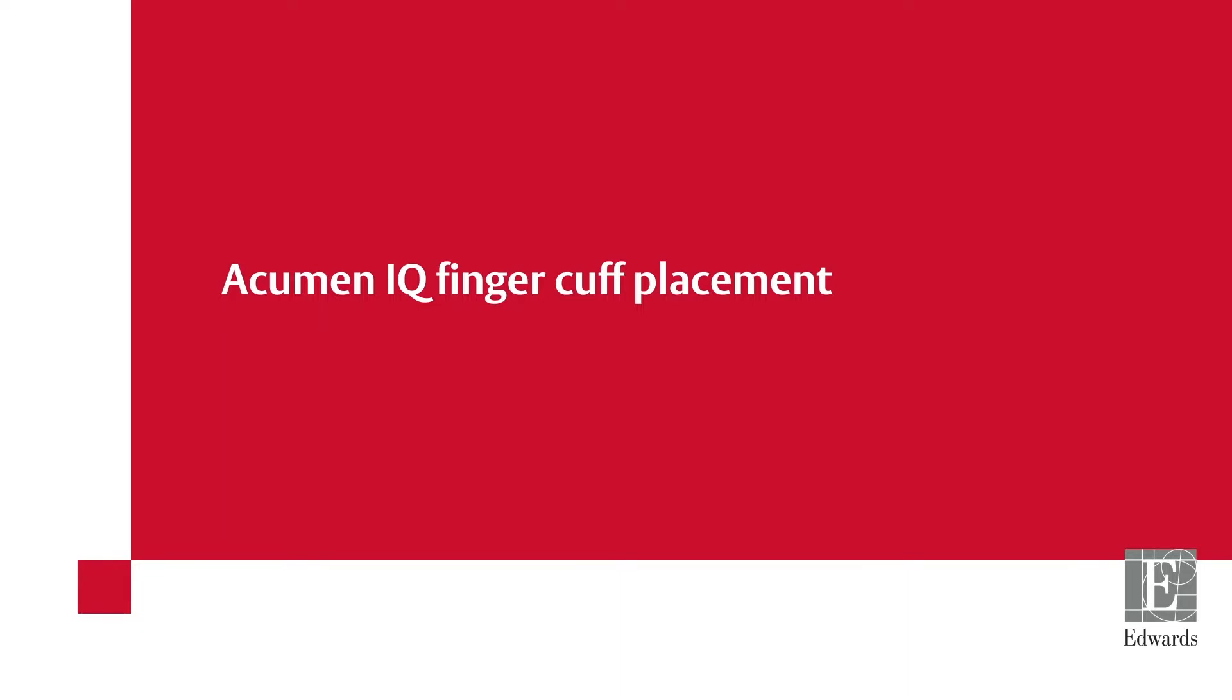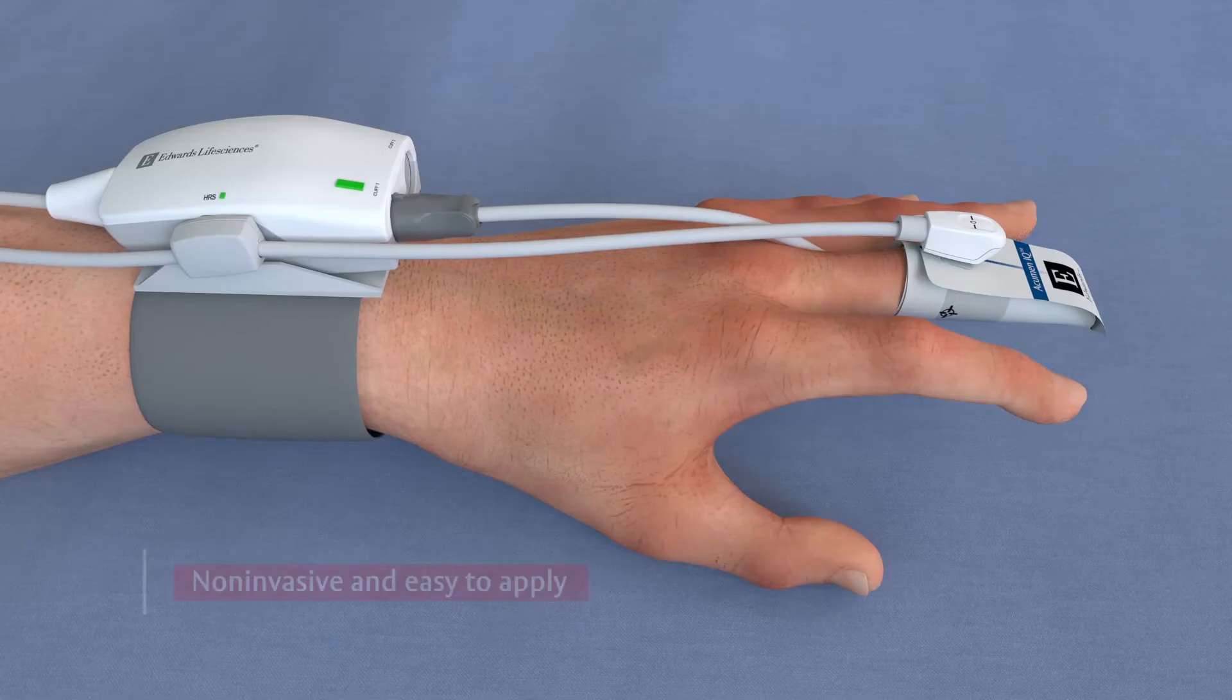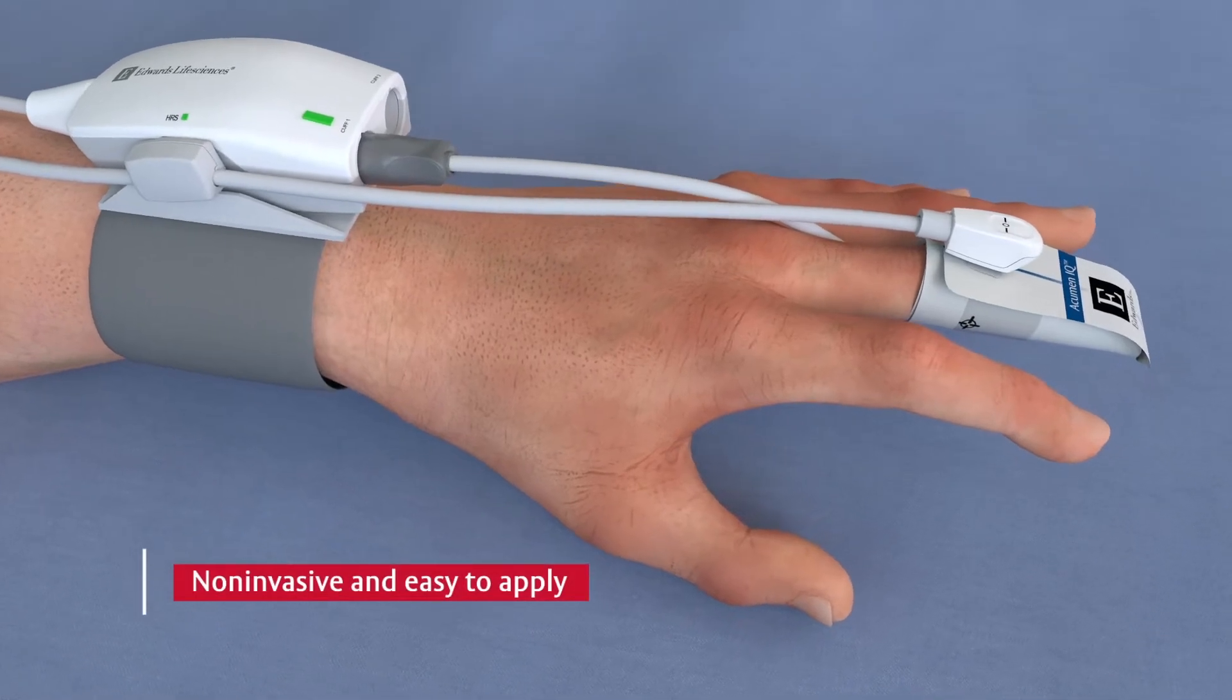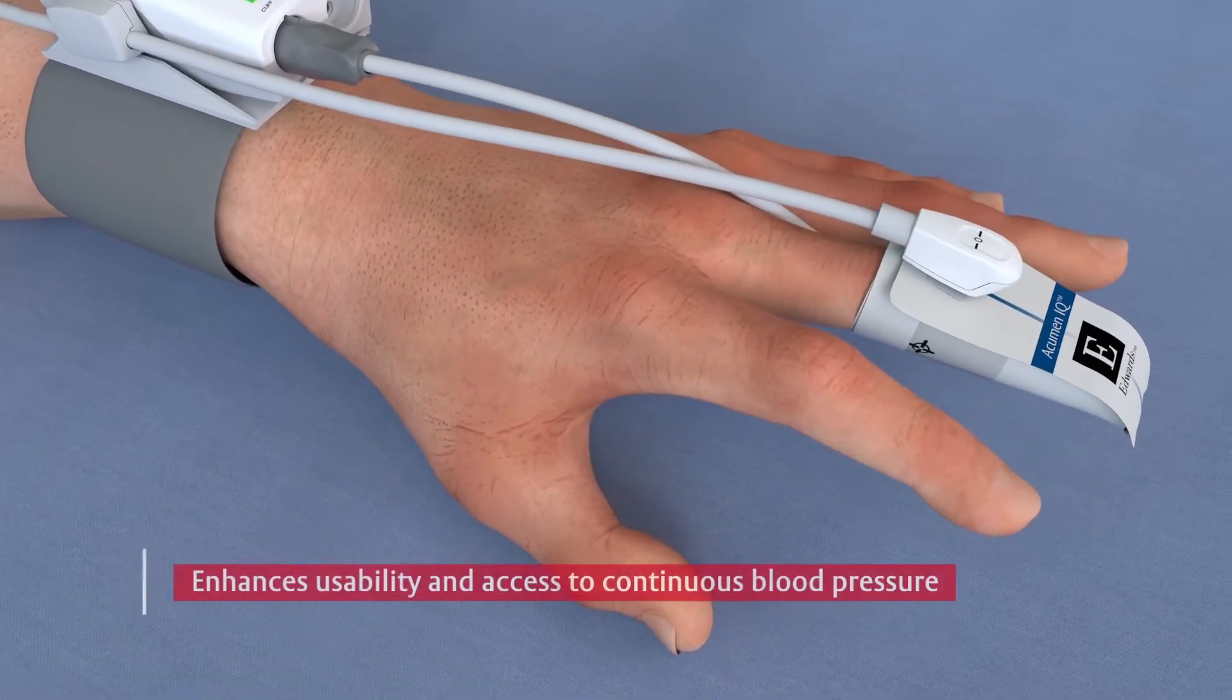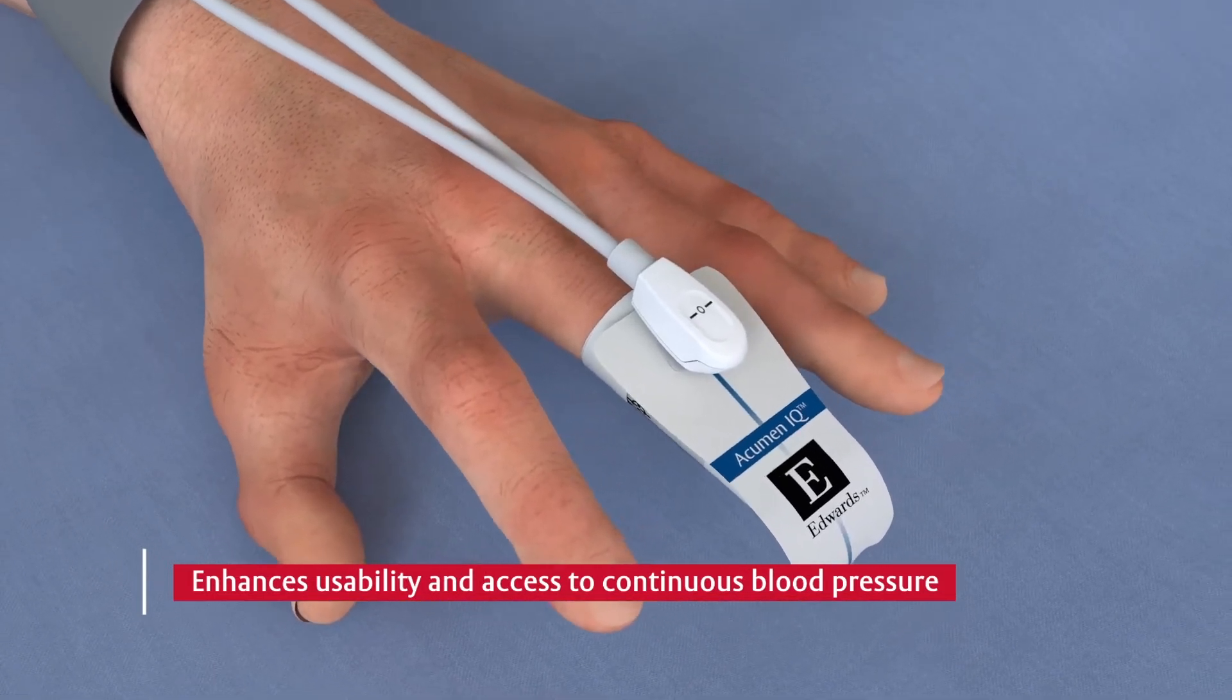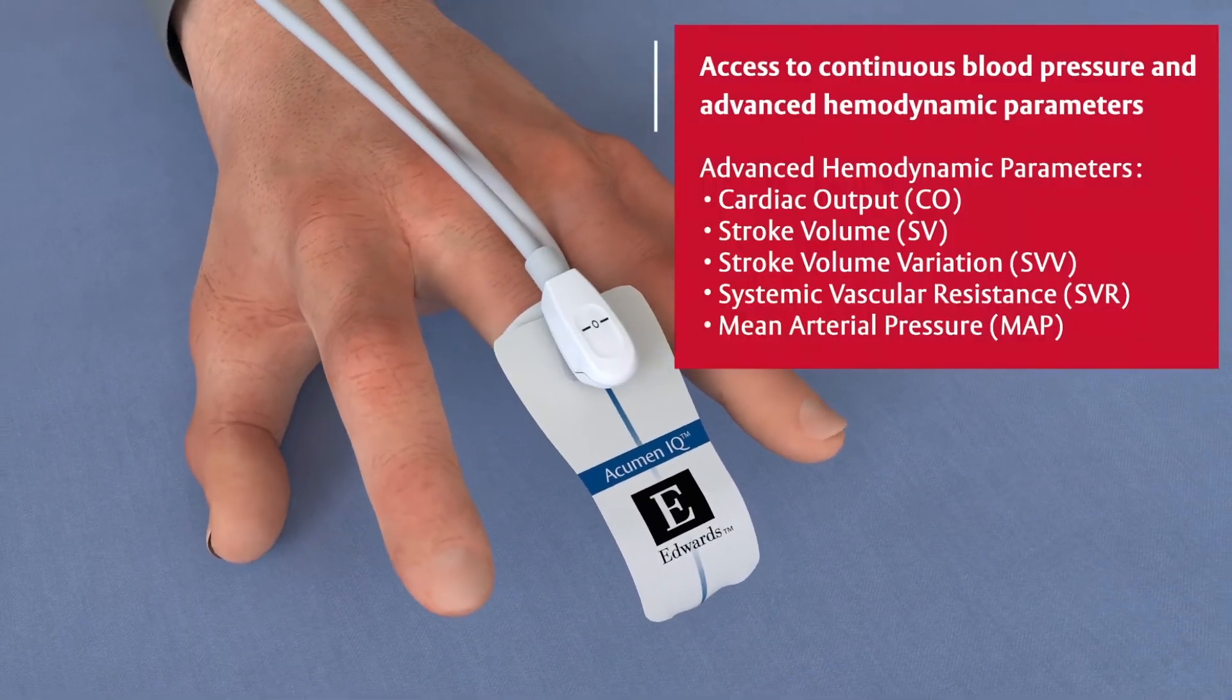AcumenIQ Finger Cuff Placement. Non-invasive and easy to apply, the AcumenIQ Finger Cuff enhances usability and access to continuous blood pressure and key hemodynamic parameters.